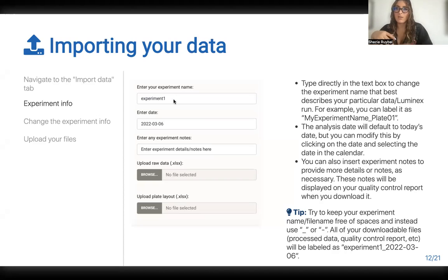I think it's a good way to keep track of what's happening, especially when we get on a roll and start analyzing plate after plate after plate, and when we have thousands and thousands of samples, hopefully this will help keep track of different things.